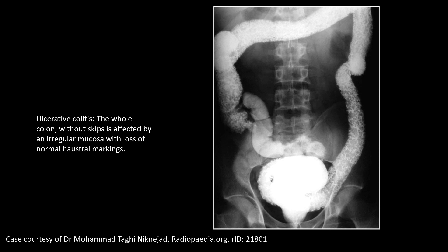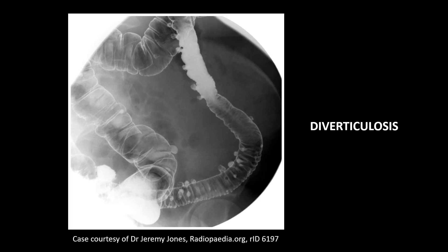Here are some important cases identified by barium enema studies. In the first image, there is no smooth lining and an absence of haustrations of the large intestine, showing a granular appearance — this is because of ulcerative colitis. The whole colon, without skip lesions, is affected by an irregular mucosa with loss of normal haustration markings. In another image, we can see small evaginations from the large intestine — these are diverticulosis.